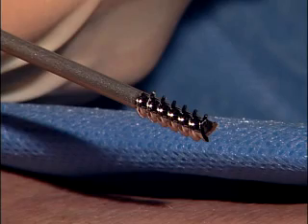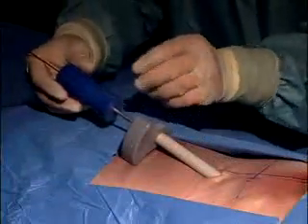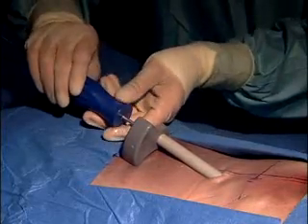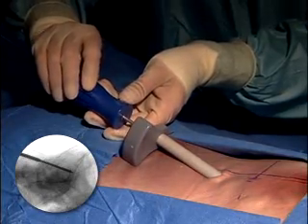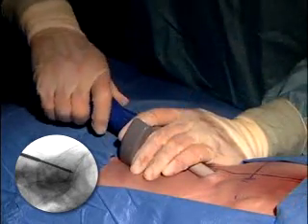The cannulated tap is advanced by hand into the bone until the tip reaches the appropriate depth, which is determined and verified by fluoroscopy. Once the appropriate depth is achieved, the tap is removed.